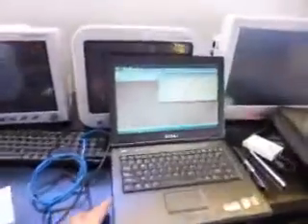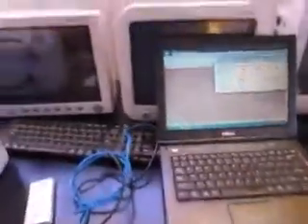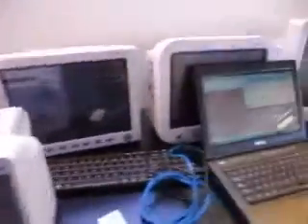Okay, today we are going to connect the IM50 with the central monitoring system, we also call CMS. Now today we are going to connect the wireless CMS, not the wired one, not using the cable. So let's take a look at the wireless router. We also call it AP.